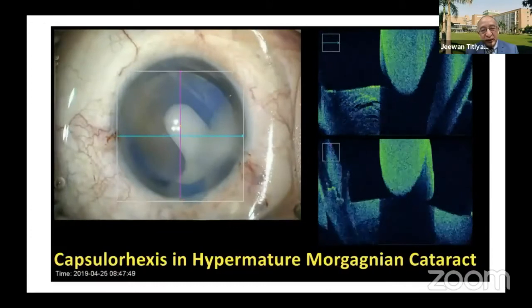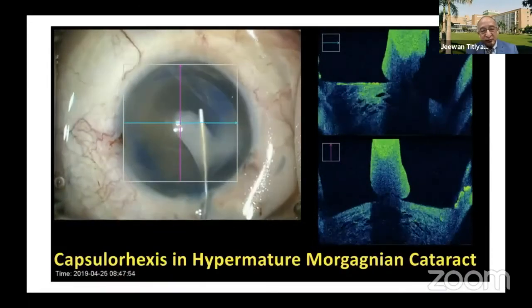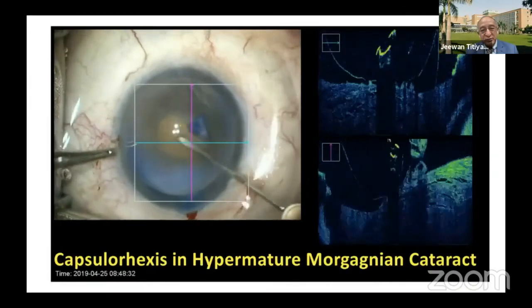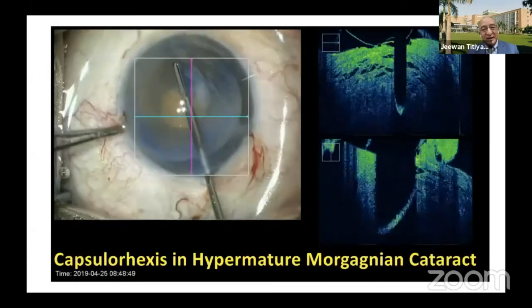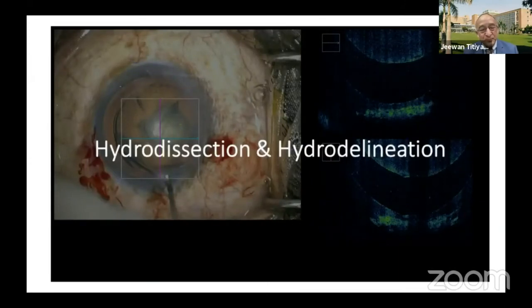In a milky cataract also, sometimes you don't see what is behind the milk. That can be picked up by the OCT microscopes. And subsequently, you fill up the bag with a viscoelastic and the rhexis can be completed. So this visualization does help in doing a proper guided capsular access also.